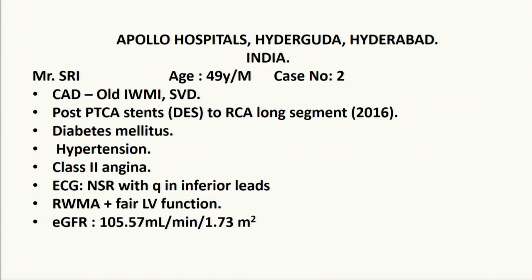He then subsequently underwent a PCI with DES. He is a diabetic, hypertensive, with fair LV function and a normal creatinine. Can I have the next slide, please?